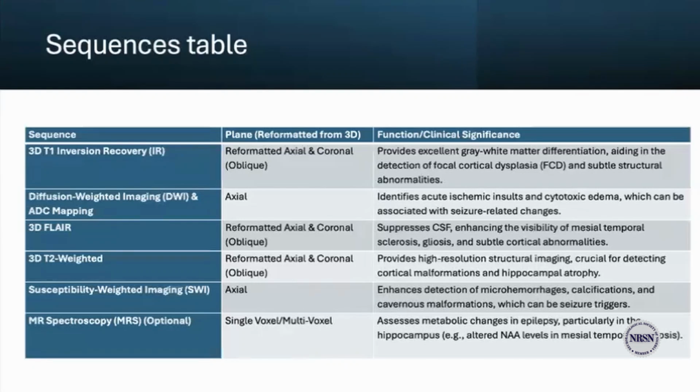In some facilities, or what is recommended, is that spectroscopy can also be of use when we're doing the seizure protocol. Currently, we're not doing it at my facility, but I would really love to hear about other people who may be running this sequence, and if it's of significant help to their facility. I would really love to hear that from you guys.